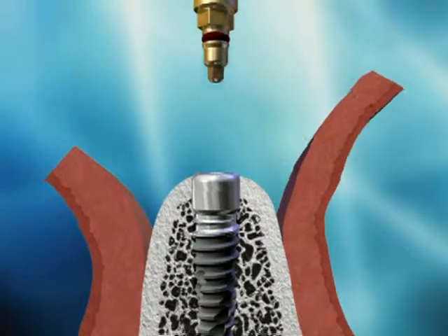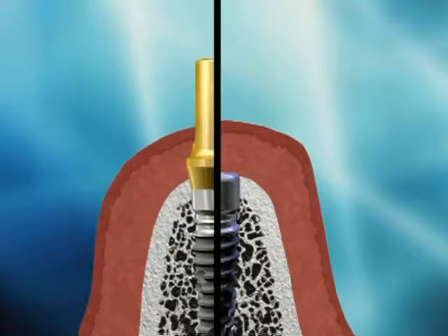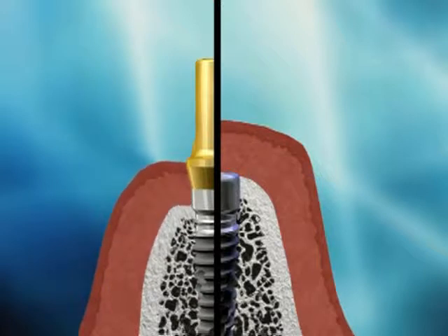When implants are initially placed within bone and then covered with an adequate layer of soft tissue, there is typically little or no crestal bone resorption. When the implant is uncovered in second stage surgery and connected to an abutment, the body then reacts, and in the process of creating the biologic width, the crestal bone may resorb.